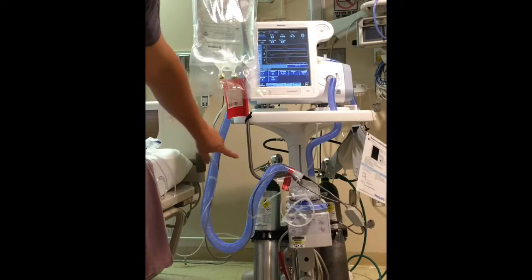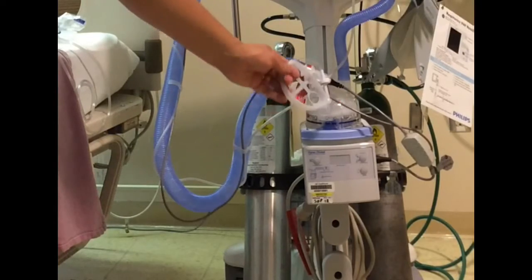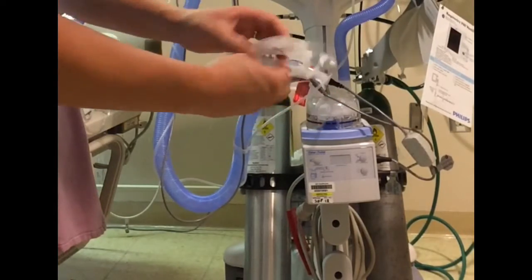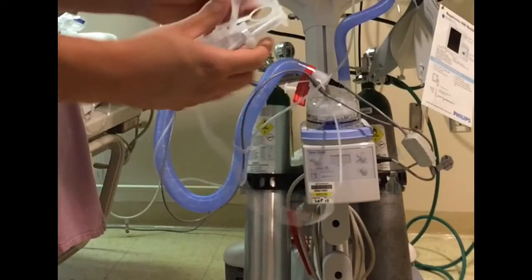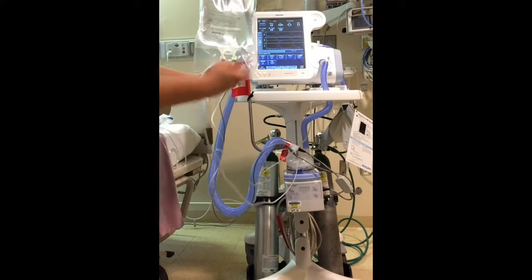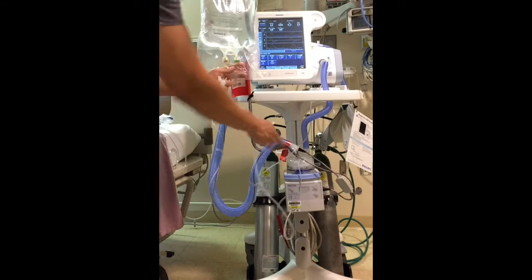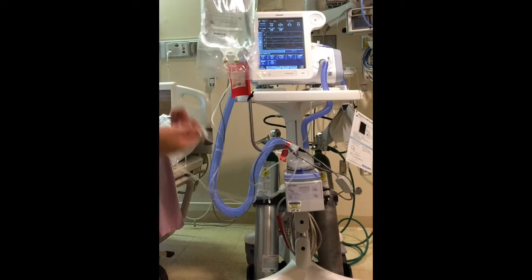Now if you want to add humidity to your BiPAP circuit, which I recommend doing, it's super easy. We got new heated circuits. Our water goes into here. So what you're going to do is grab this, undo it. There's your end. You're going to open up your bag and stick it in on the green side. Once it's on the green side, it'll be flowing into your little hot pot and giving that humidity.